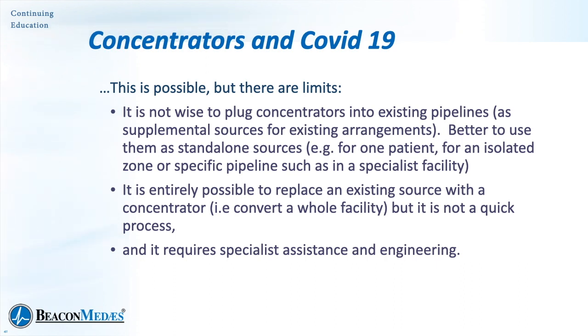Now, it is possible to replace the existing source, change over from liquid to concentrated oxygen for the whole building. Absolutely possible, but it's not a quick process. It requires specialist assistance, specialist equipment, specialist engineering. So in the crisis mode, we're probably not going to do that. However, it is a consideration for the future.